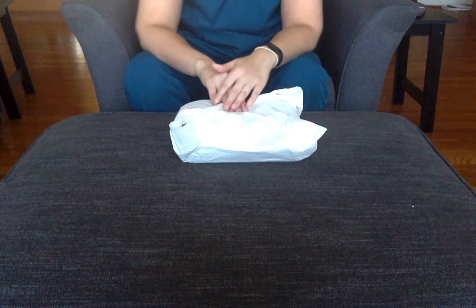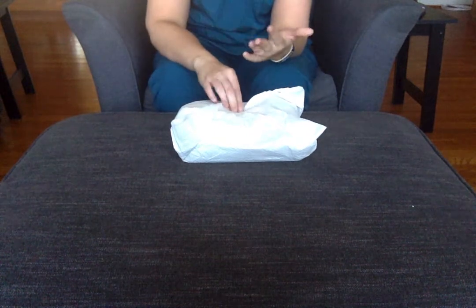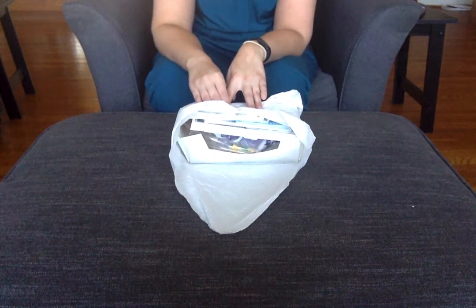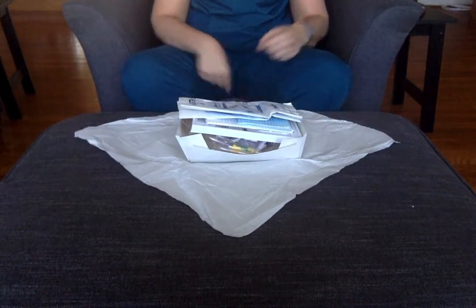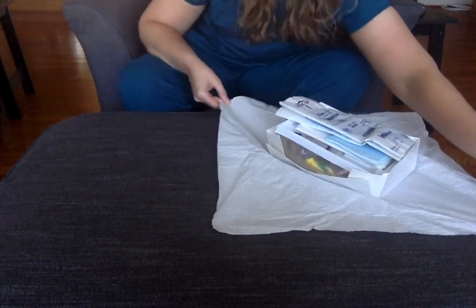Today we'll be using Betadine. So I've got my sterile package here and I need to open it. When I open my sterile field I always open away from me first so I never have to reach back across my sterile field. I'll open one side, the other side, and towards me. I'm going to slide this over so I have room to put on my sterile gloves.